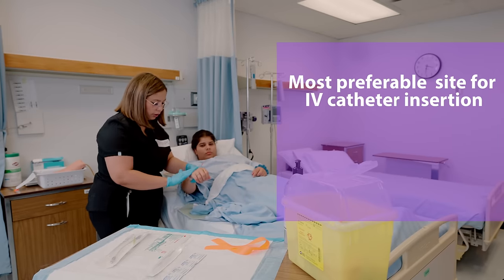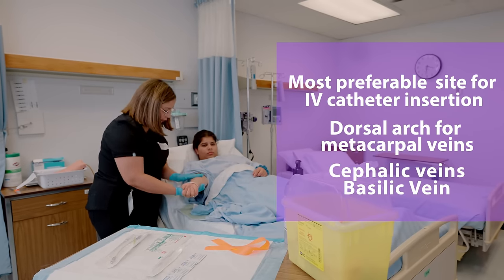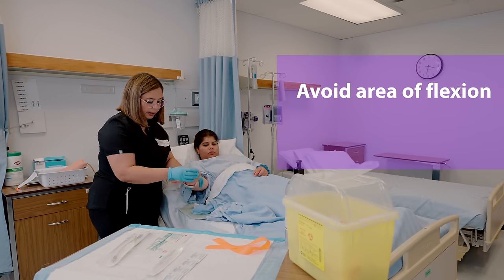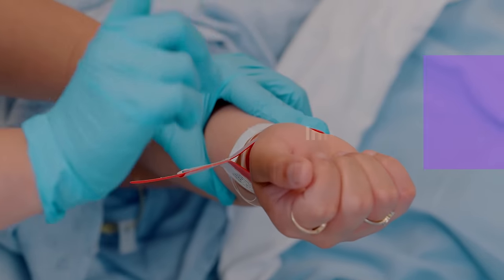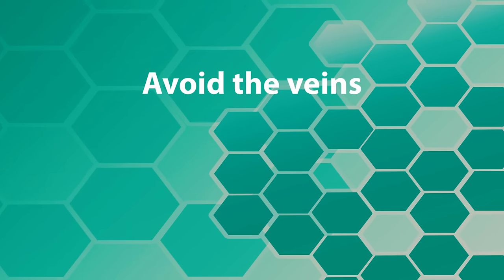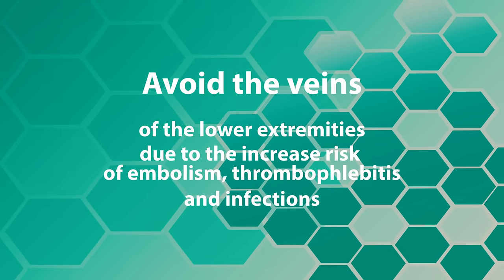Most preferable sites for IV catheter insertion include the dorsal arch for metacarpal veins, cephalic veins, or basilic veins. The nurse should avoid areas of flexion — for example, avoiding the inner aspect of the wrist to reduce the risk of damage to the radial, ulnar, or median nerves. Also avoid the veins of the lower extremities due to the increased risk of embolism, thrombophlebitis, and infection.